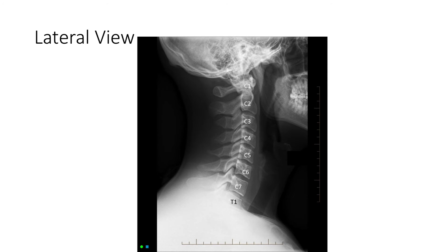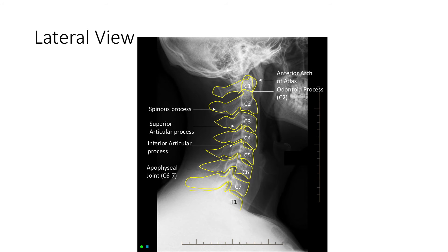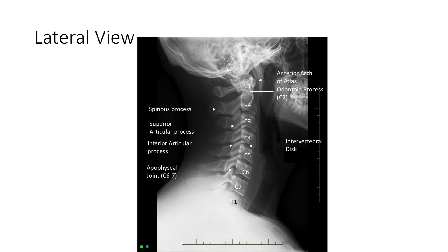Next we will look at the bones, tracing the cortical outline of all the bones to check for any disruptions. Then we will look at the disc spaces, which should all be approximately equal in height at the anterior and posterior margins and equal at all levels — the spaces should all be roughly symmetrical. Lastly, we will look around the edge of the image to check for any other visible structures, such as the trachea, which is anterior to the soft tissue.